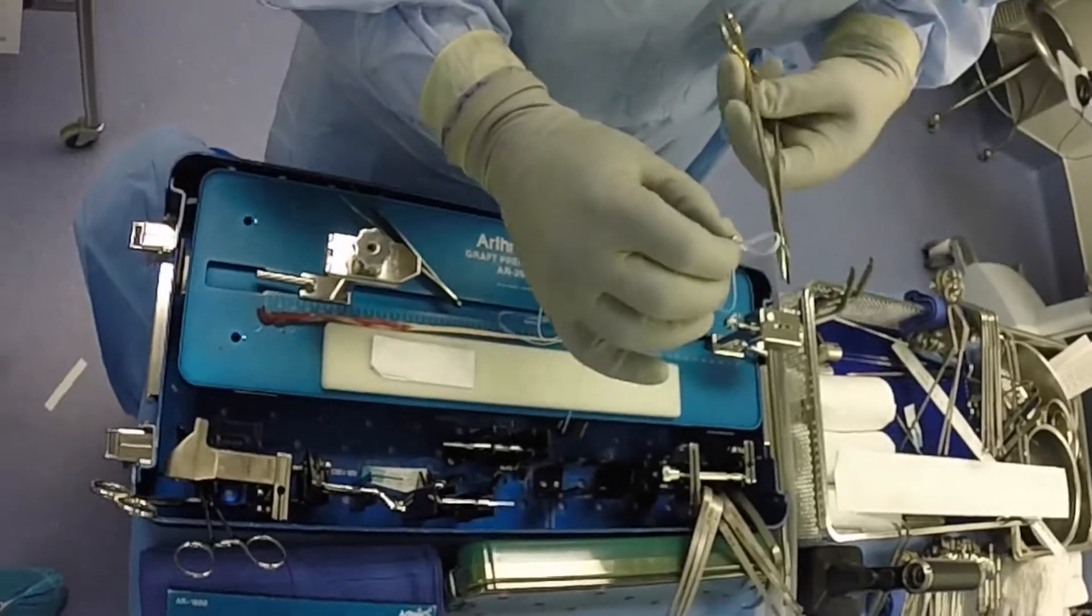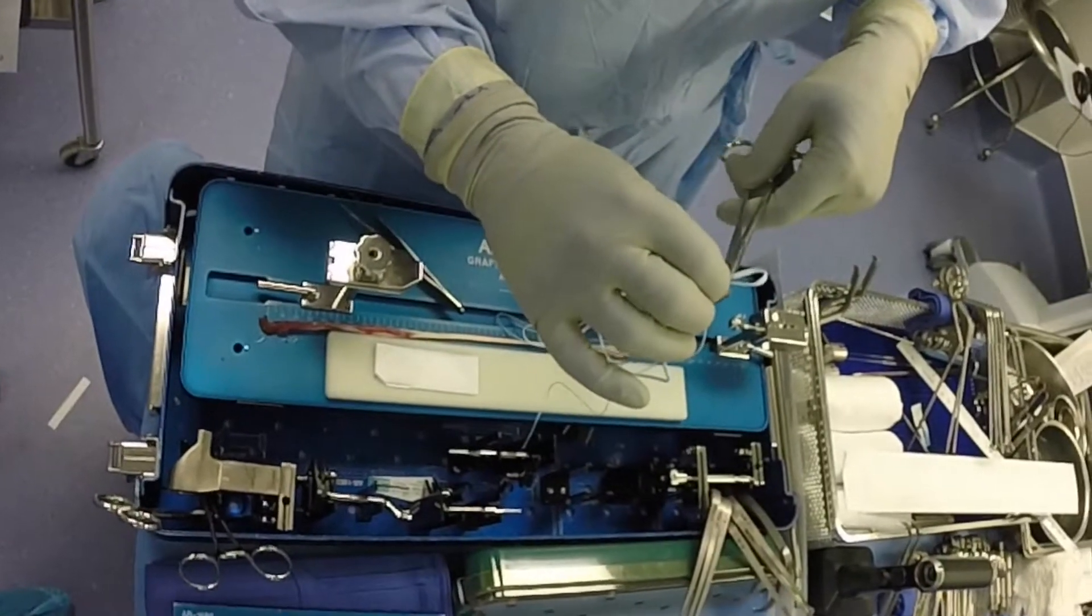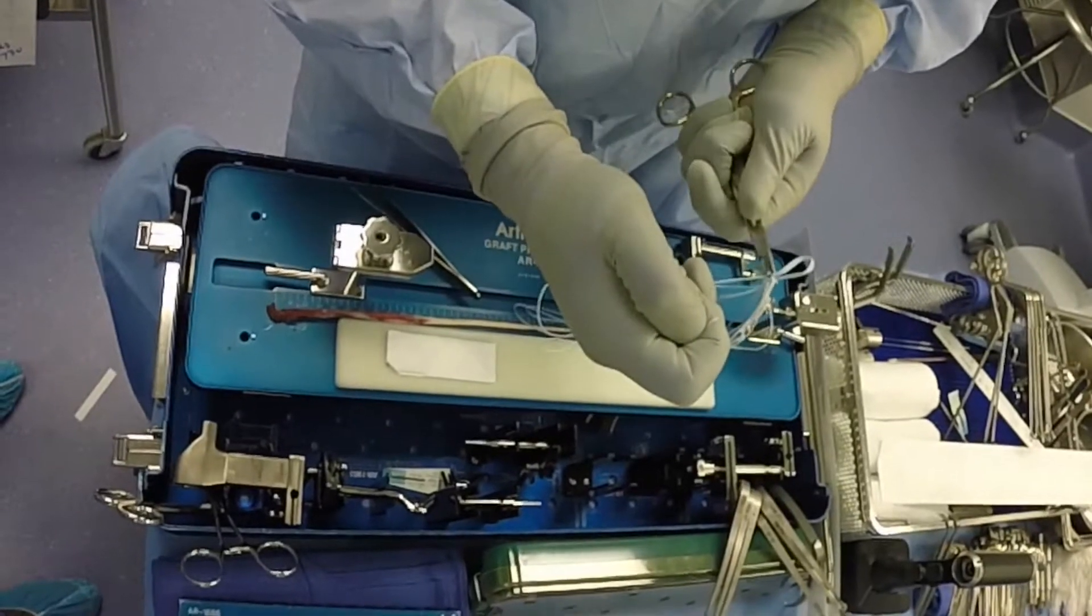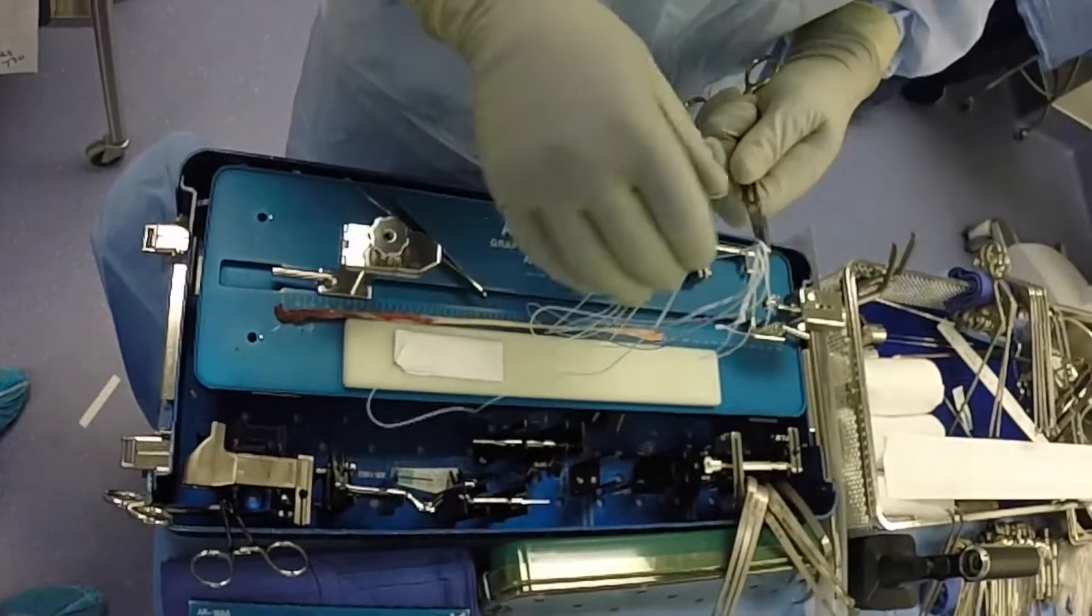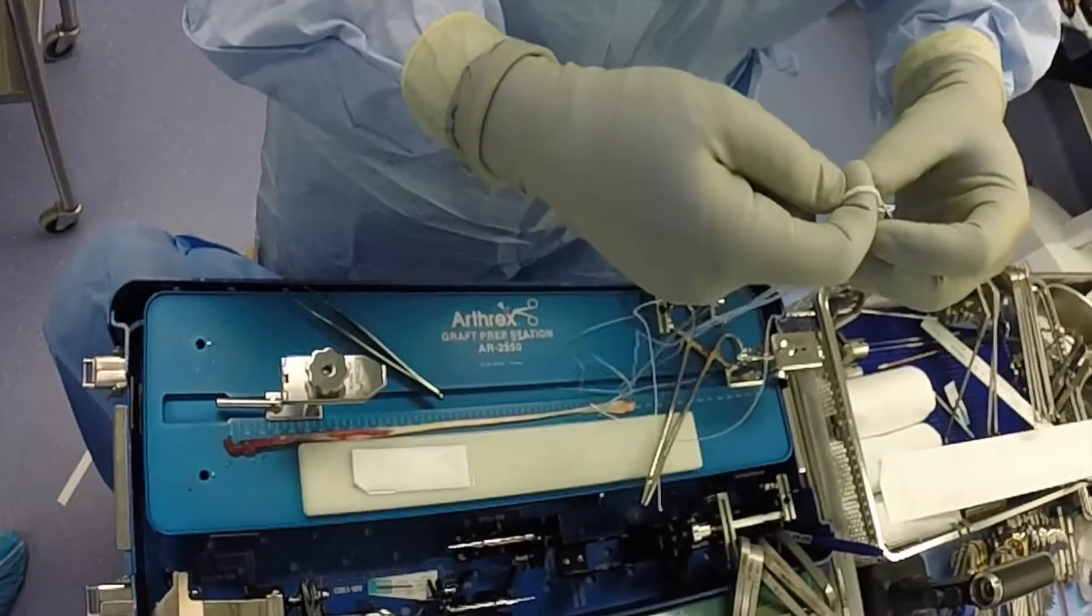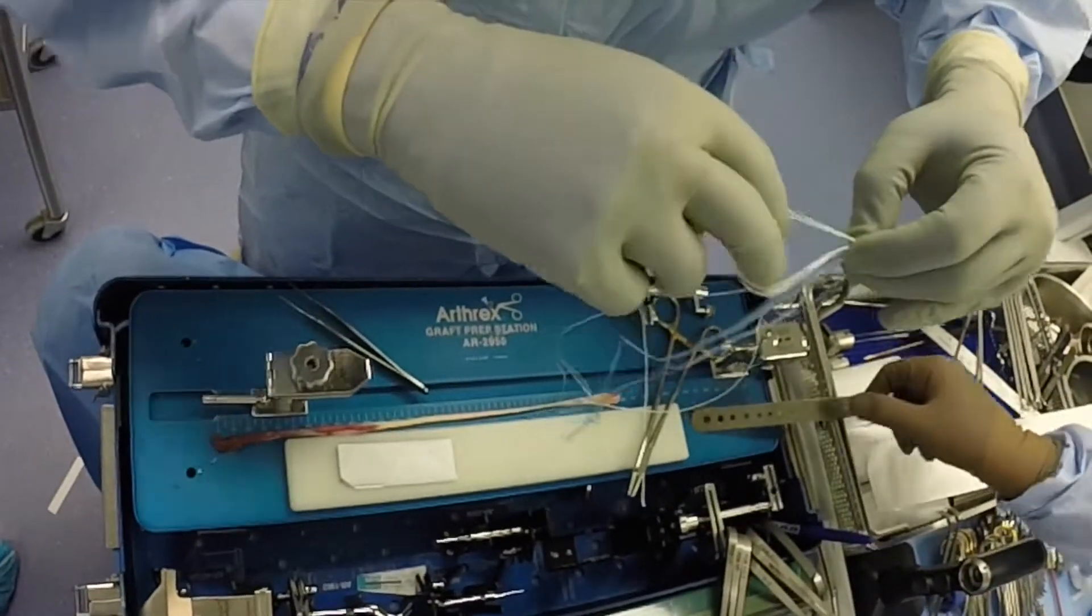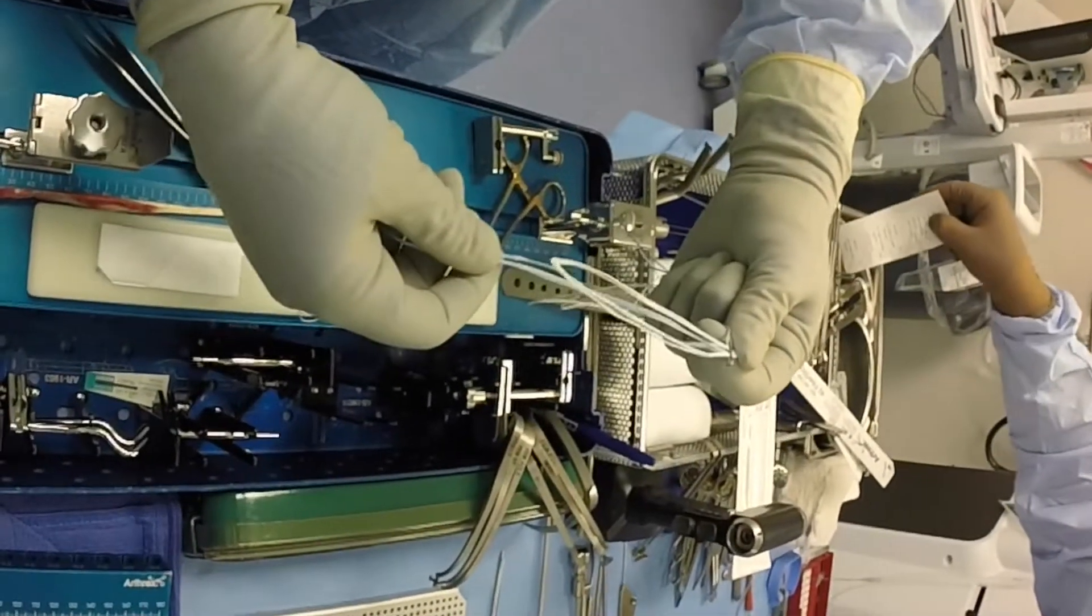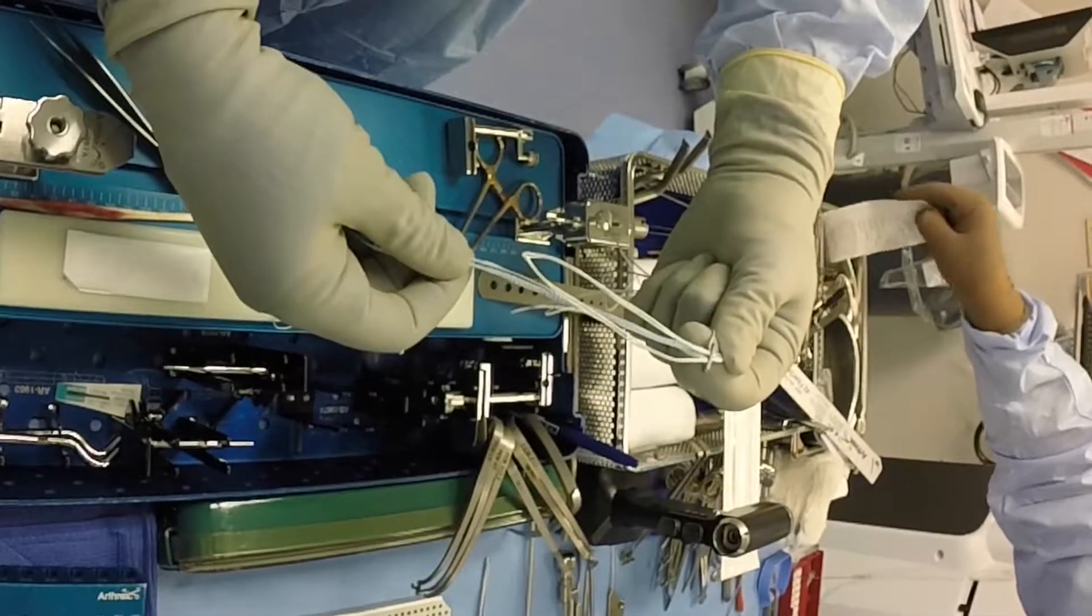Care is taken to fully seat the FiberTape suture against the button in such a manner that the all-inside device functions properly. Here you see the loop for fixation of the graft is pulled down against the button, and that's how it should look prior to loading the graft.